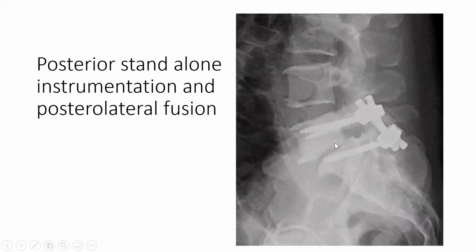It's a spondylolisthesis, still a bit of disease. I haven't restored the disc height here. The foramina look narrow, but I'll probably undercut the facet joints, so I'll decompress this directly. But I have got the lordosis here, and this vertebra should probably be angled like that. So there's remaining kyphosis, and this is how I used to fix it.